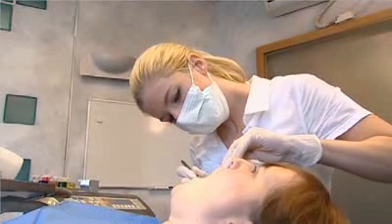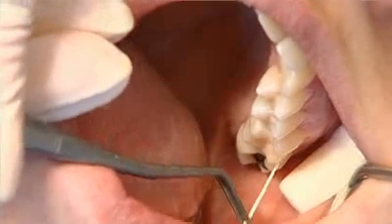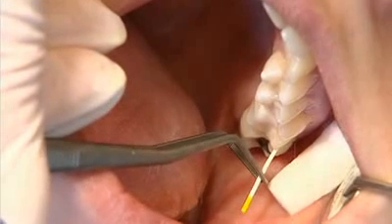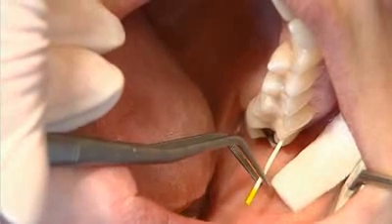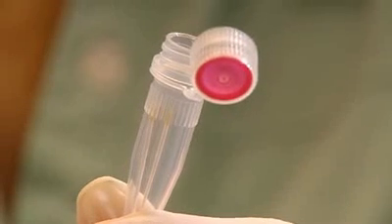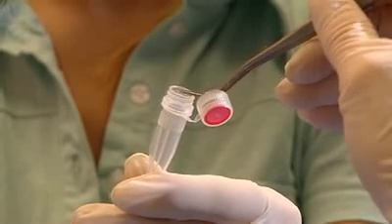In the case of a pool specimen, the specimen is taken from the deepest or the most inflamed gingival pocket of each quadrant. At each specimen site, 1 paper point is inserted to the bottom of the sulcus using sterile forceps. Let the paper point sit at each specimen site for at least 10 seconds. Place the paper points, with the point facing forwards, into the transport tube with the red cap. Up to 5 paper points can be combined together in the transport tube with the red cap.